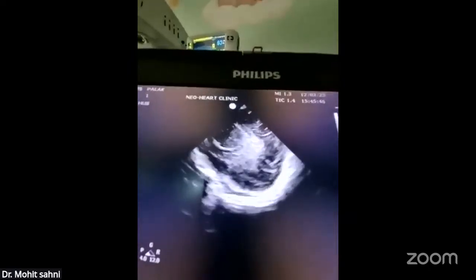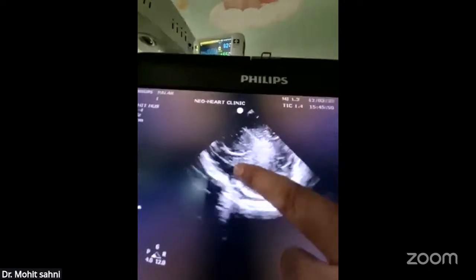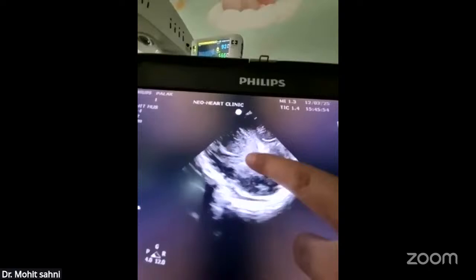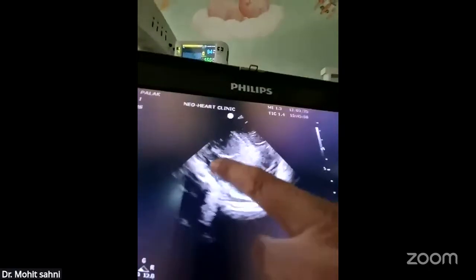And then we go more lateral. So this is parietal lobe, occipital lobe, inferior. This is temporal lobe, and this is Sylvian fissure.